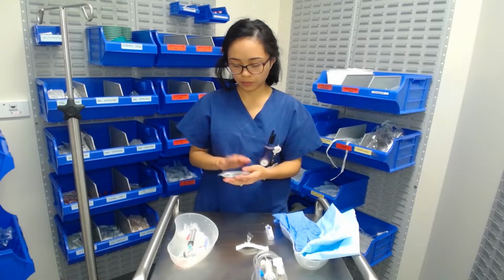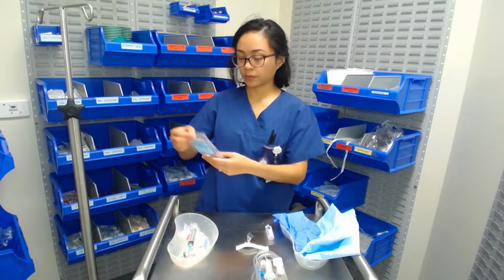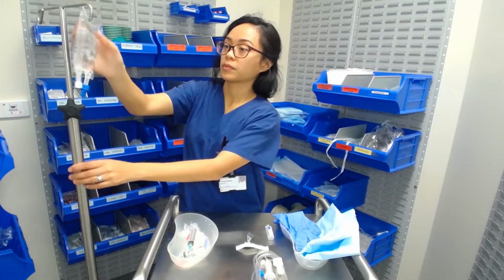So now I'm going to show you the preparation of the medication before it's injected into the bag, but from a bird's eye view.